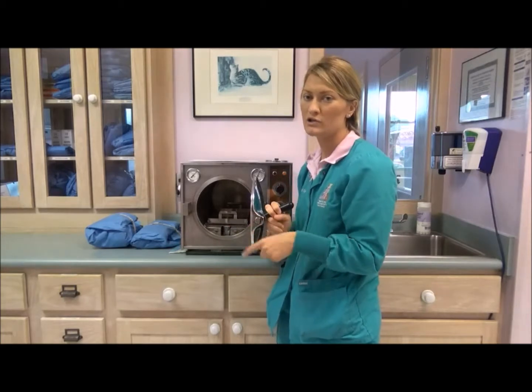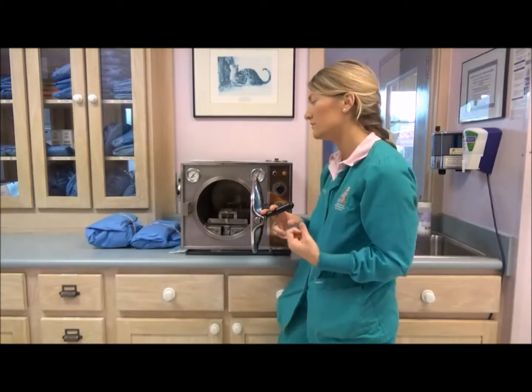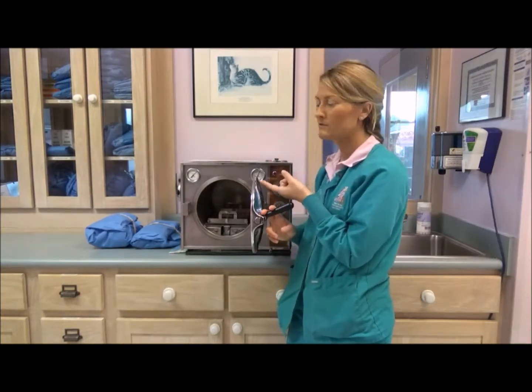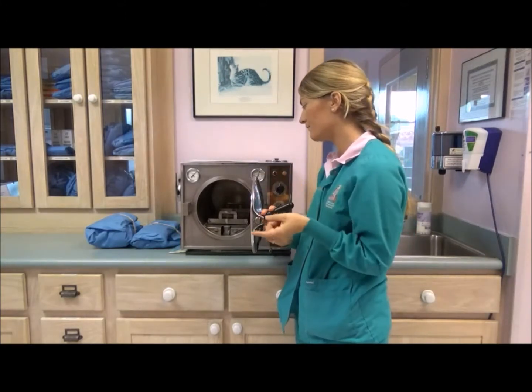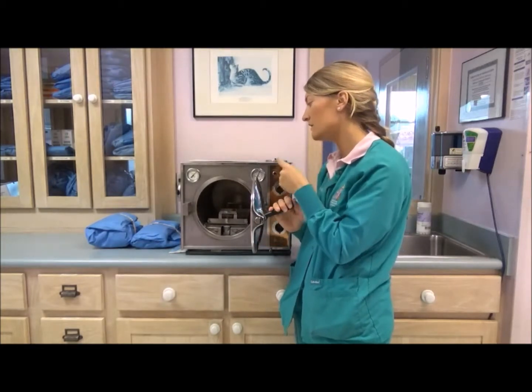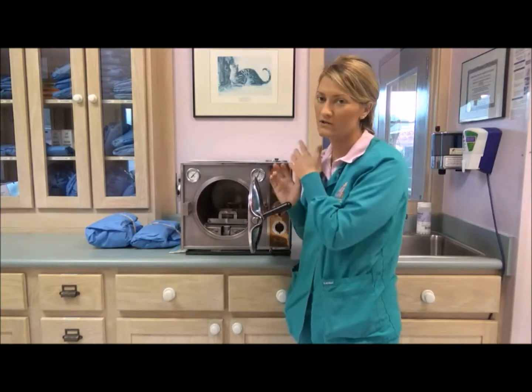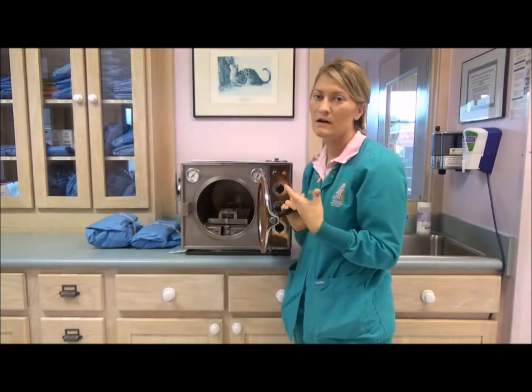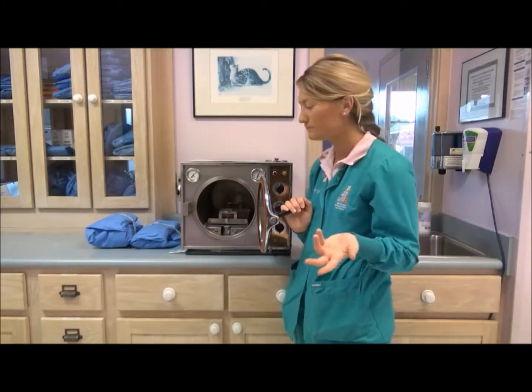And then steam pressure builds up in the machine. Some of the steam will escape out through a port in the machine. But once enough pressure has built up, it'll heat things to the appropriate temperature. And then after that cycle has been completed, the steam will condense back to water. So if the autoclave does its job properly, everything inside of those packs has become sterilized, meaning that all microorganisms have been killed.